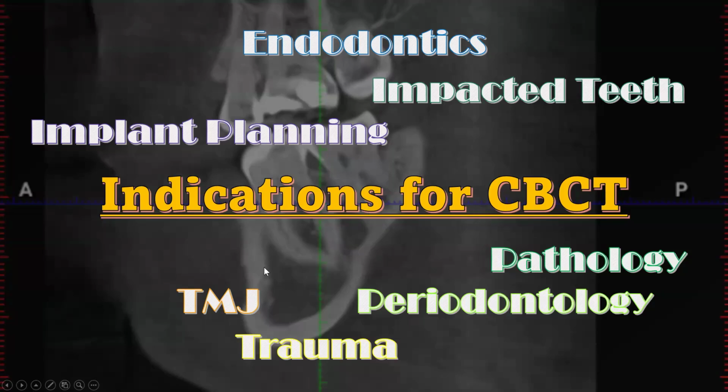But one of the drawbacks or limitations of cone beam CT is soft tissue visualization, and you can't actually see the articular disc. Even in medical CT, you can't see the disc. MRI is the only one that shows the disc. So it does a better job than Pano, other imaging we have.